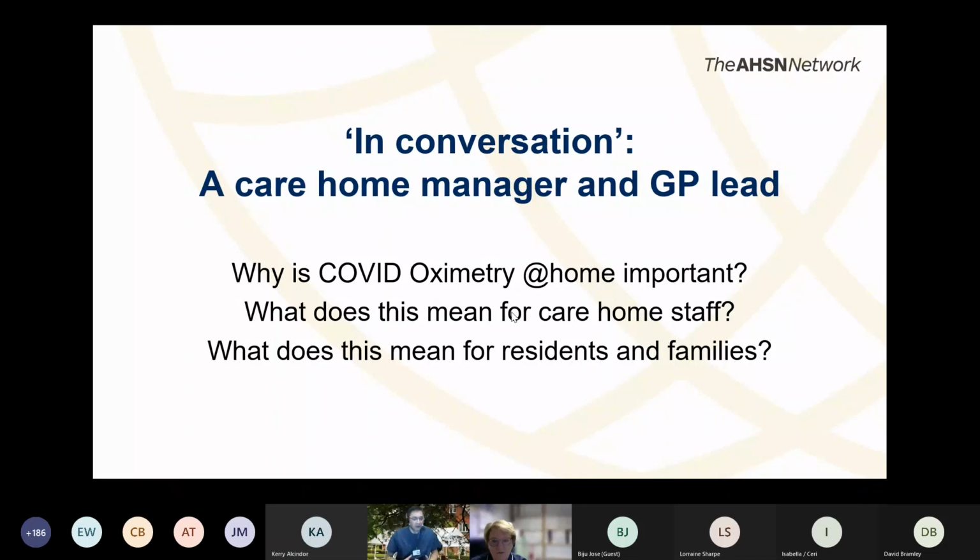And the way that you have been supporting the staff at the Manor to be able to use some of the devices. I know that you have nurses, but you have care staff at the Manor who have been trained to really support the residents by doing some simple observations. The things that we were doing before COVID were to use blood pressure monitors, to use temperature, to use pulse, and to use oxygen saturation as a way of identifying patients who may be more ill than we would recognise, and we built up a language about that, didn't we, Kay?